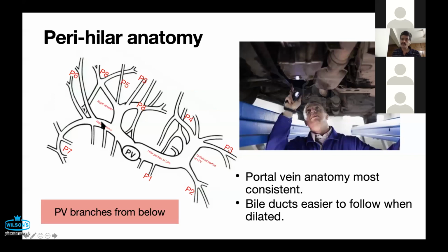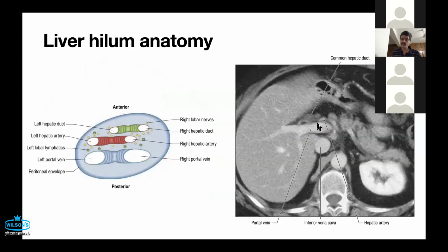So when you demonstrate the liver from the duodenum by rotating your hand to the left or anti-clockwise, this is the kind of demonstration of the radicals that you will get. This is even in the CT scan, the hilar structure shows you these are anterior. Then are the hepatic artery. Then are the portal vein. So regardless of the variations in the hepatic vascular structures, this orientation at the hilum sort of remains true.